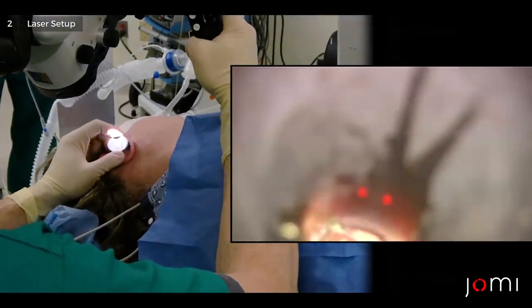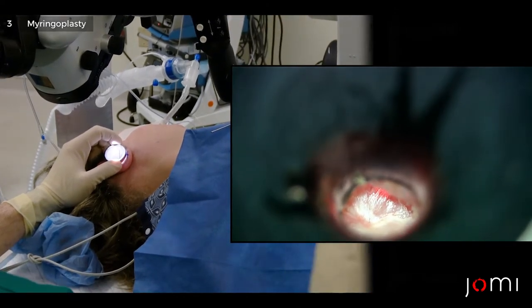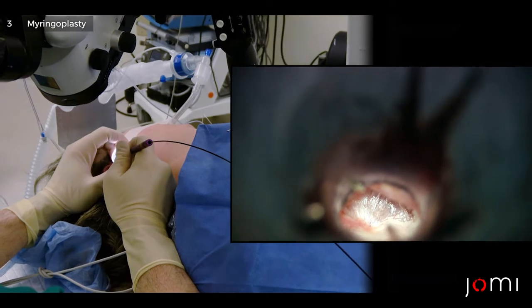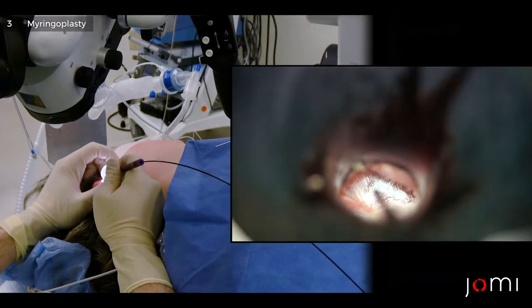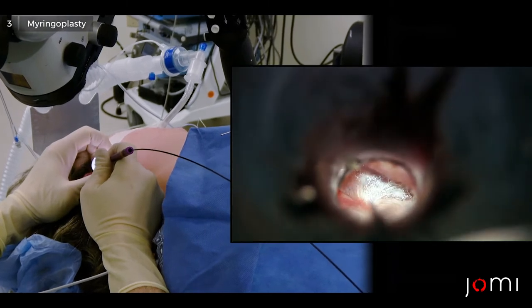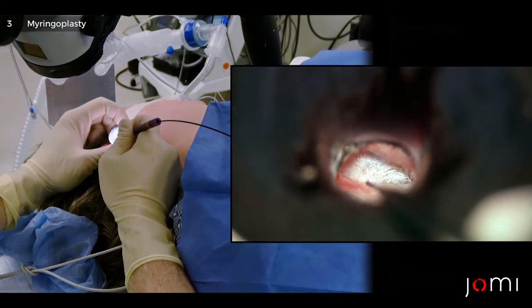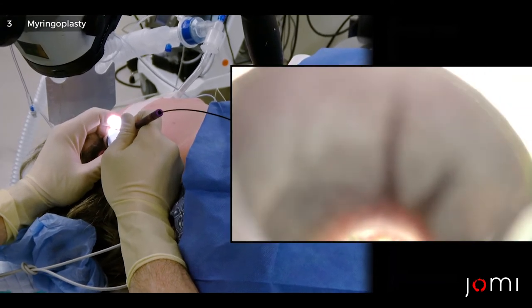I'll turn her head away just a little bit to get a good view of that hyperinflated area. Take the laser — you want a diffuse firing, you don't want it too close because that'll burn a hole. So I start back very far. Laser on. You can see there's the argon blowing. As I zap it, it's blanching, it's not burning. You see how it's tightening.